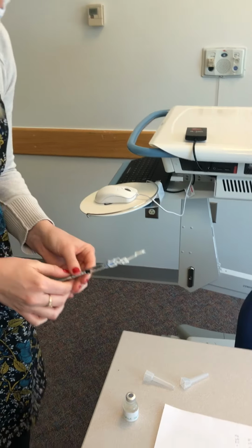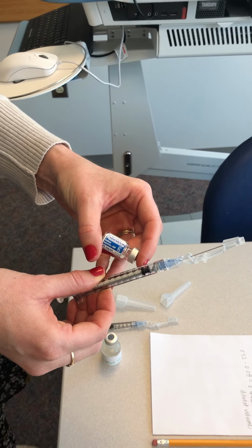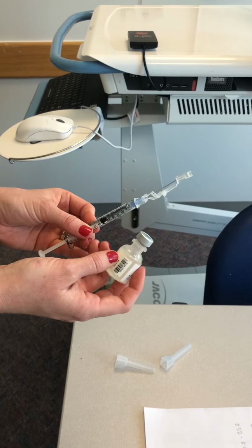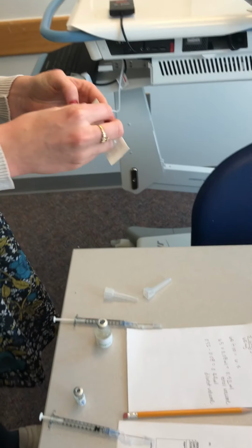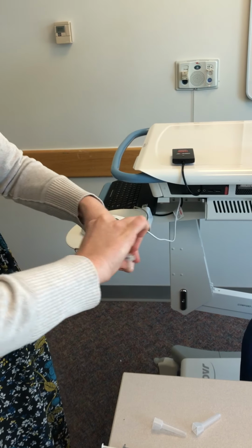Just to confirm here, Val, I pulled up 0.08 mLs of the Phenobarb, Yep. and then I pulled up 0.44 mLs of our saline vial. Perfect. And then I'm going to use our safety device, the female to female connector, and connect those two.